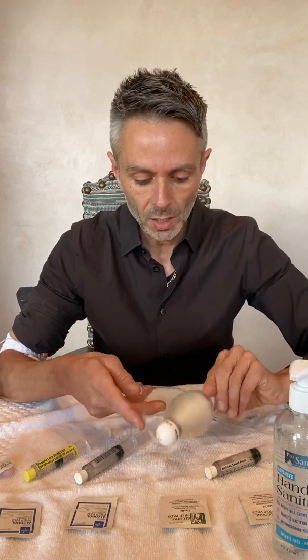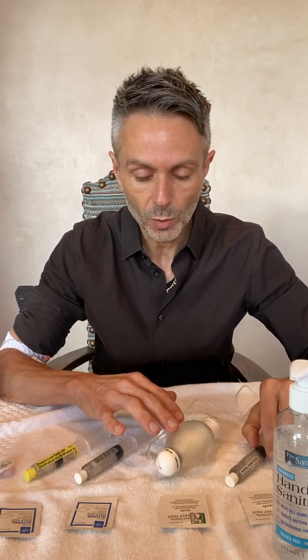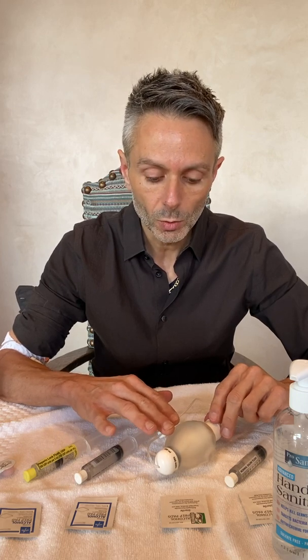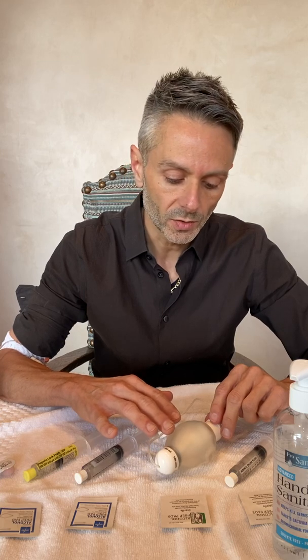Your medication is inside this ball. A lot of times this type of medication is required to be refrigerated, so before you actually administer this medication you want to take it out of the refrigerator and let it sit out for about 30 minutes so that it can get to room temperature, because if you put cold medication into your vein it can make you really cold. So let it kind of get to room temperature.